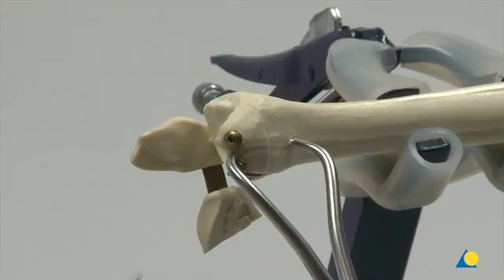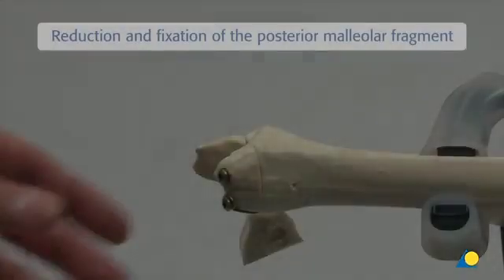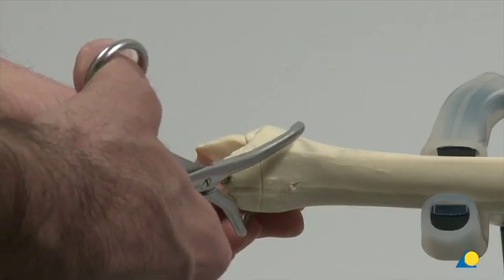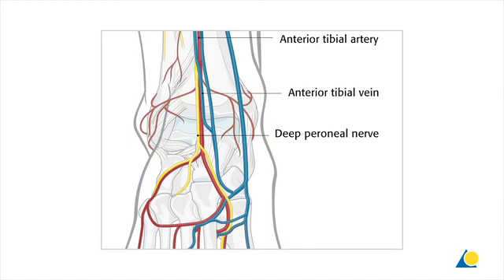The next step is the reduction and screw fixation of the posterior maleolar fragment from anterior. For the purposes of the practical exercise, the reduction of the posterior maleolar fragment is held using the pointed reduction forceps. Clinically, it is important to allow visualization of the tibia in order to avoid damaging soft tissue and neurovascular bundles during drilling and screw placement. A stab incision is made anteromedial in order to be perpendicular to the fracture of the posterior maleolus.